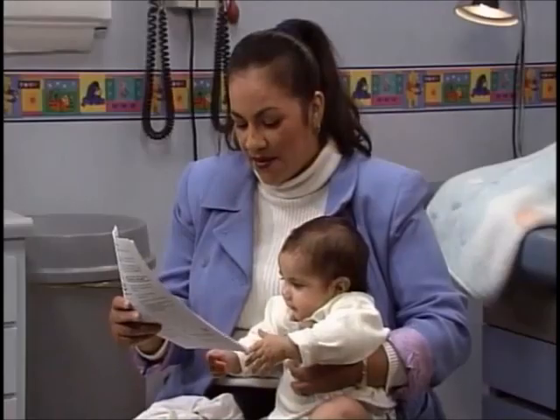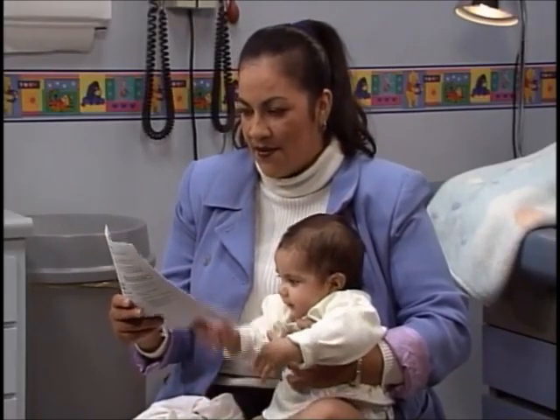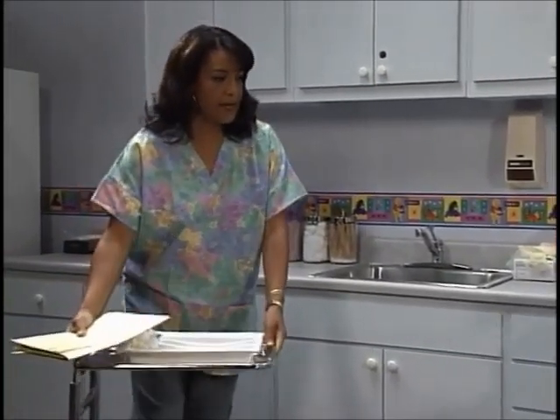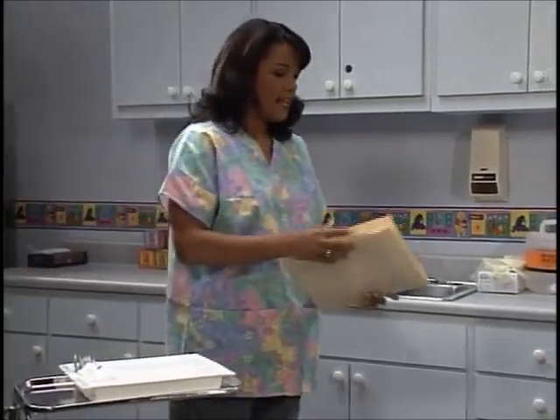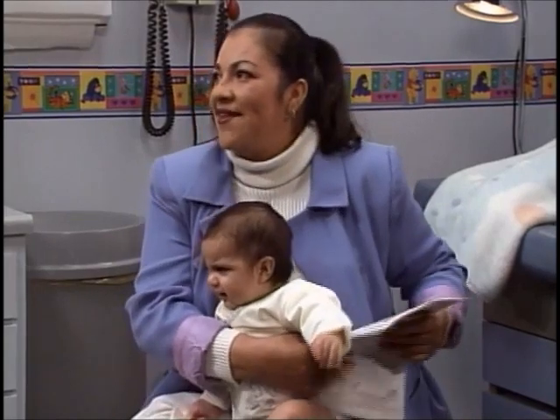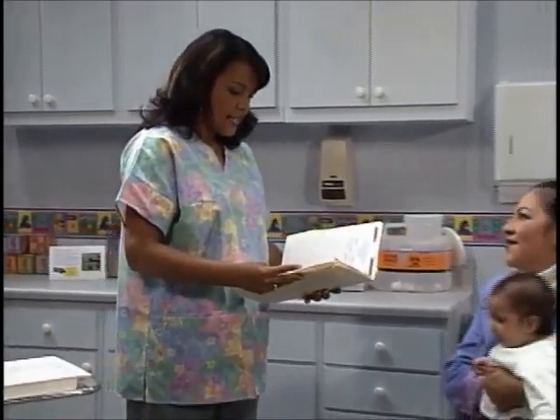In the first demonstration, we will see and discuss the techniques and skills needed to administer vaccines to an infant. We will be showing both intramuscular and subcutaneous injections. This infant will be receiving 4 immunizations: DTaP, a combination Hib and hepatitis B vaccine, IPV, and pneumococcal conjugate vaccine. The mother has already read the vaccine information sheets, and the child has been screened for possible contraindications and precautions.